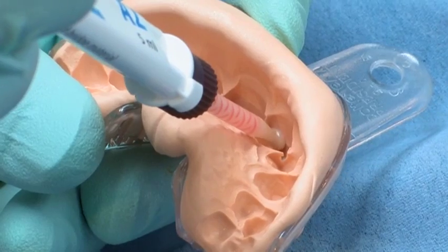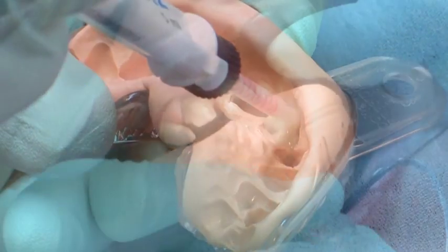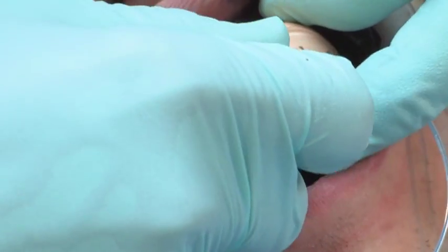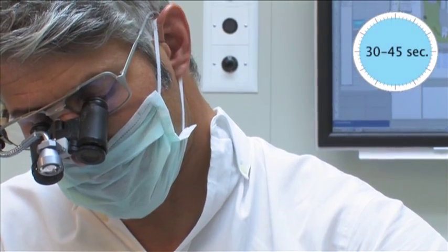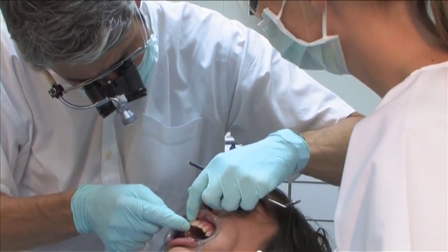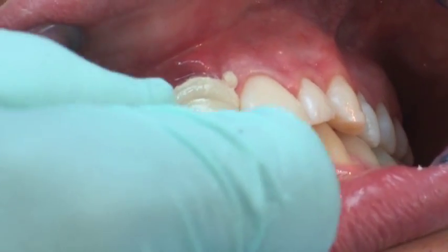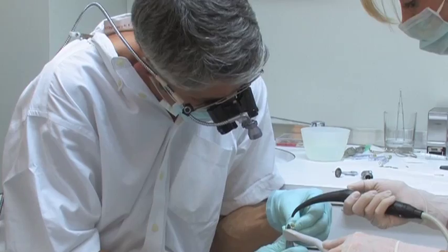After isolation of the preparation with Vaseline, the provisional restoration is fabricated using Cool-Temp Natural. The material reaches an elastic consistency after a short duration of time in the mouth and can be easily removed from the mouth together with the preliminary impression. The unfinished provisional restoration is positioned again onto the preparation to check its fit.